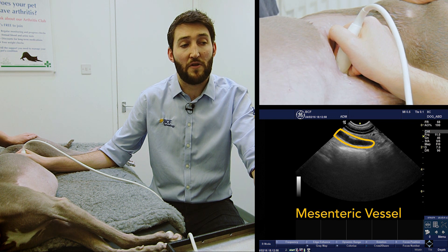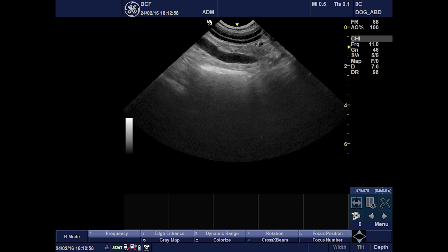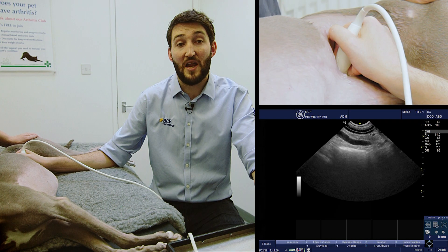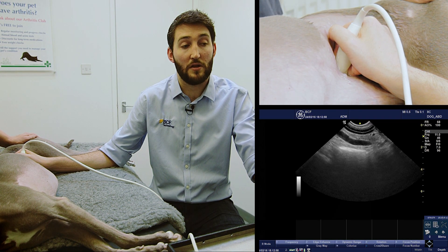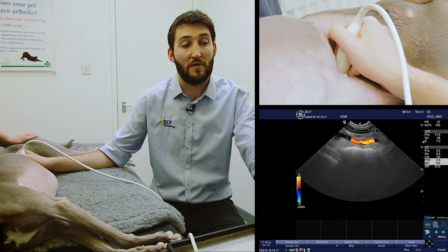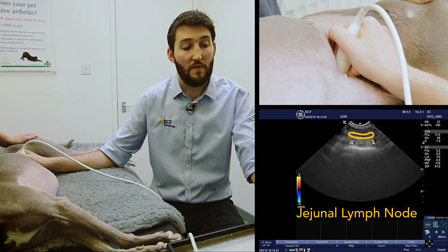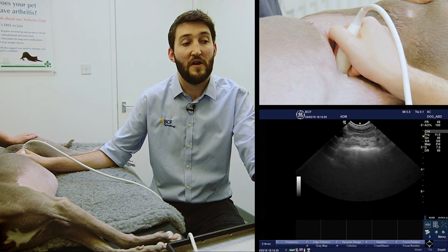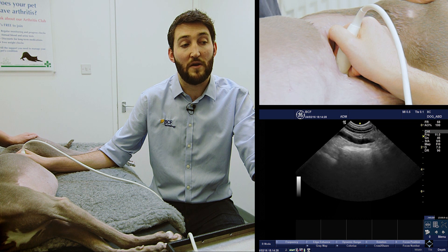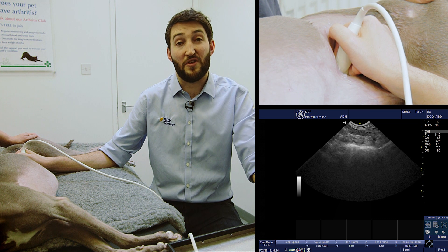Here we can see one mesenteric blood vessel on screen, and just above it — slightly to the left in the dog — we can also see a mesenteric lymph node. This image shows how difficult it can be to spot them, as they can appear a little like blood vessels. If your machine supports color Doppler, you can apply it to verify: with a little fanning, the structure at the bottom shows color flow — that's the vessel — while the structure above it, which had no flow, is the lymph node.